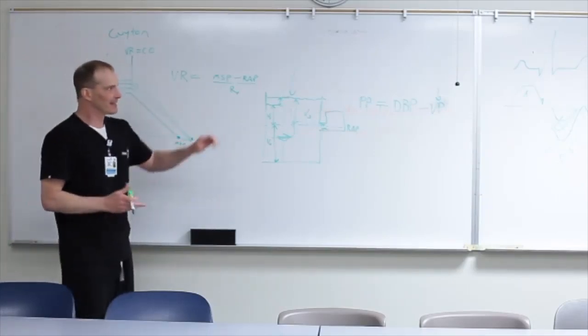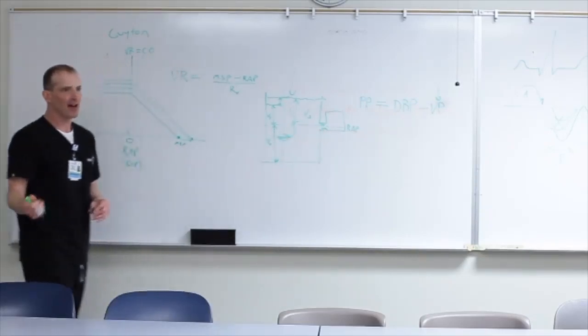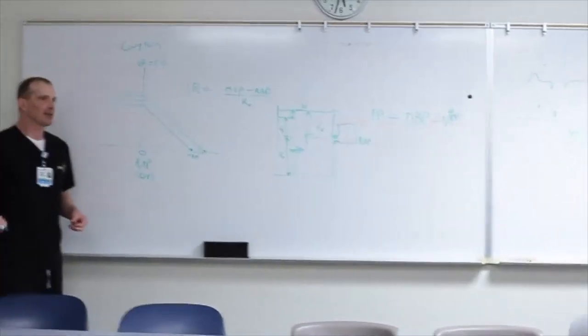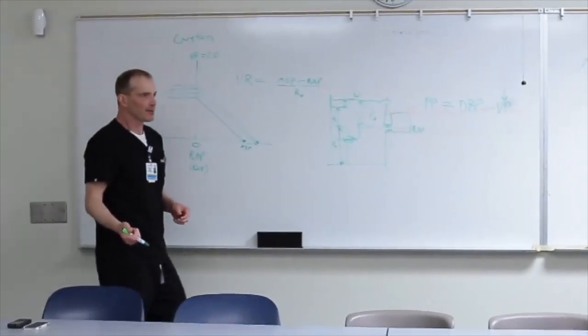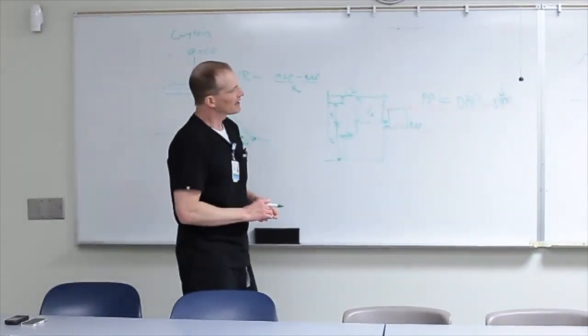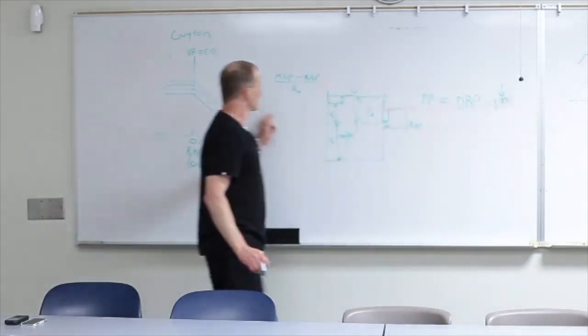Maybe not exactly what the waves are, but if you're going to be looking at hepatic vein Doppler, which I hope will get you to, or understand what's happening with portal vein Doppler or renal Doppler or any of this stuff, it all comes down to this, and it all comes down to this stuff here.